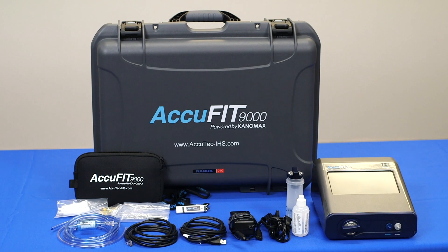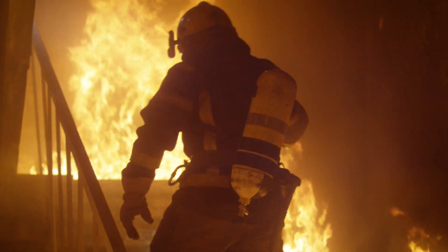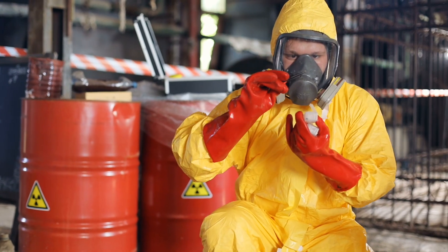Designed with all respirator users in mind, the AccuFit 9000 is a quantitative respirator fit testing solution for respirator users working in healthcare, emergency response, and industrial settings.